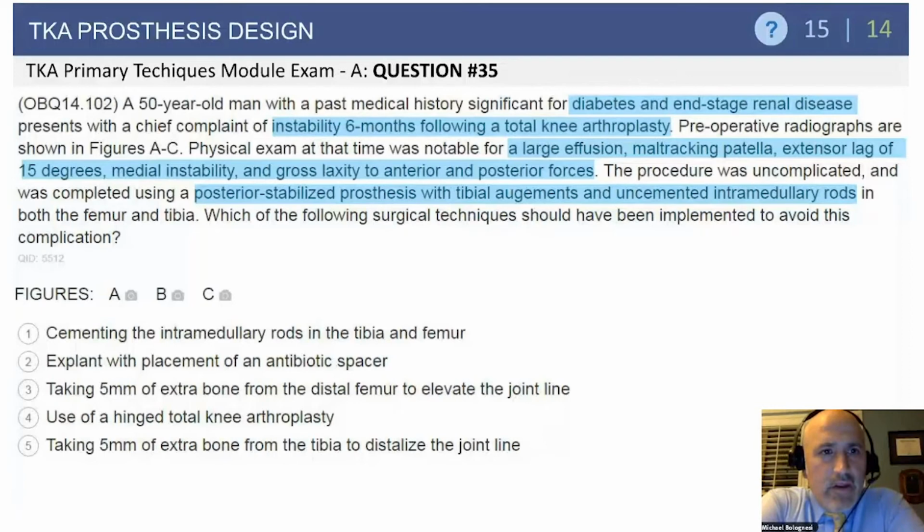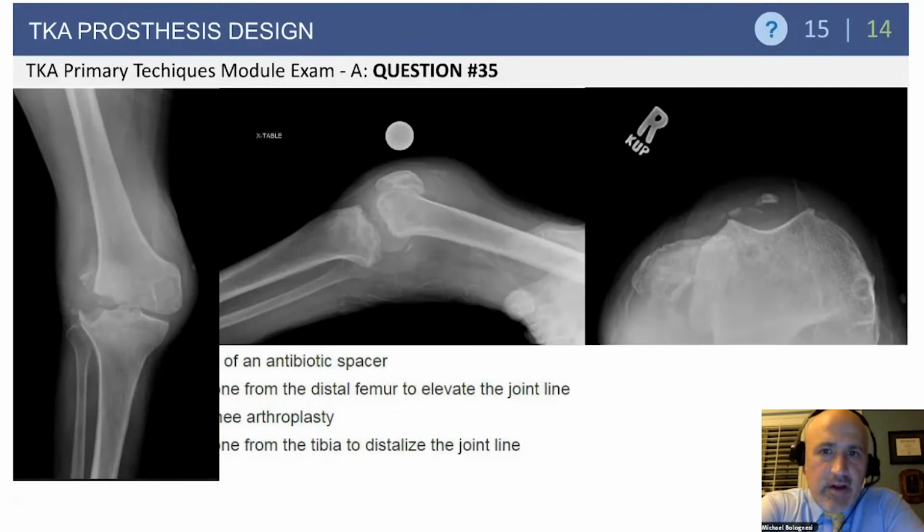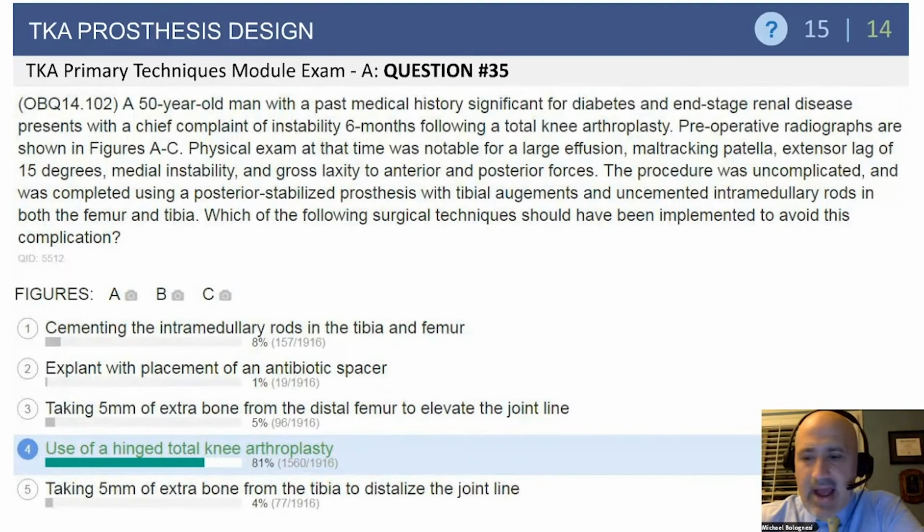Our next question: a 50-year-old man, a patient with diabetes, end-stage renal disease. He's got instability after a total knee. We've got some radiographs we're going to look at. He's got a large effusion, maltracking patella, extensor lag, medial instability, gross laxity. It was an uncomplicated procedure using a posterior stabilized prosthesis with tibial augments and uncemented intramedullary rods, both the femur and the tibia. And what they're proposing is, how could you have avoided this?